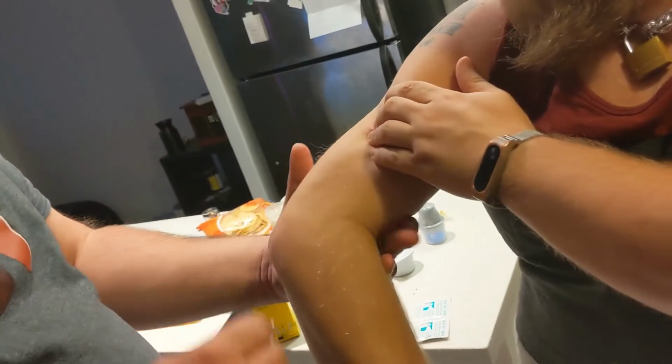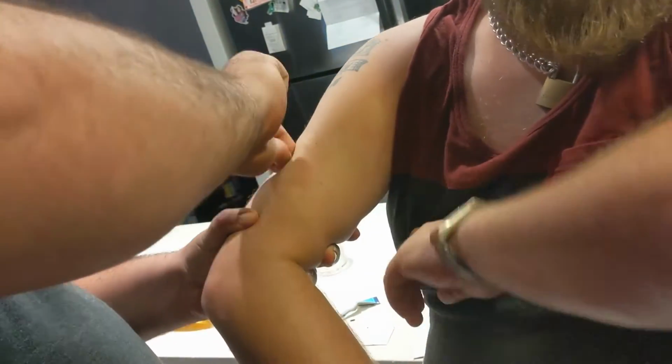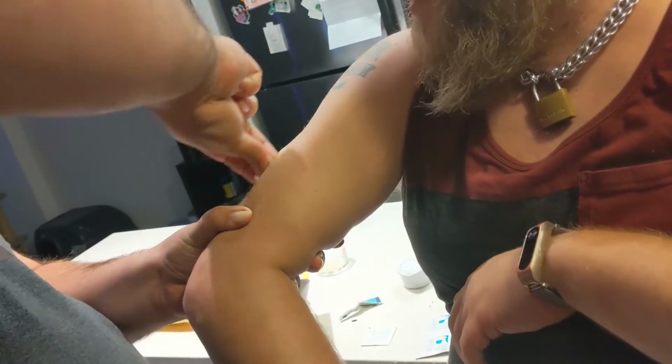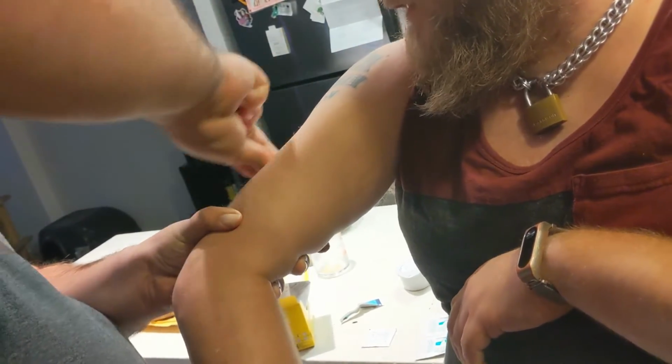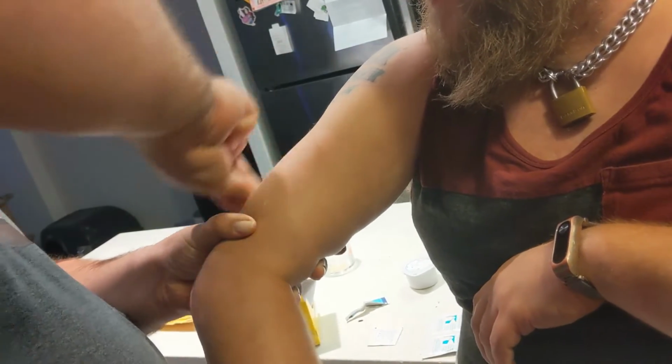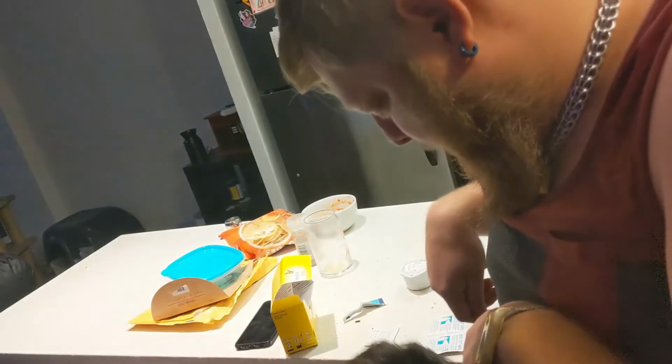And then I'm just going to spend some time cleaning off. Because we gotta wait for this to dry anyway. Let the alcohol dry. Alright, getting there. Cool.